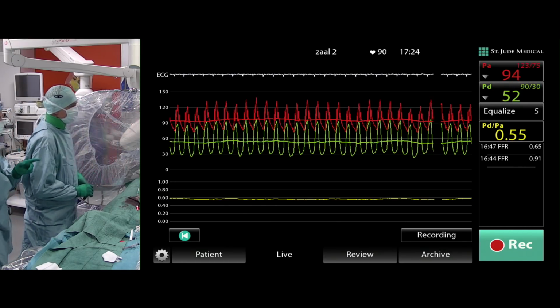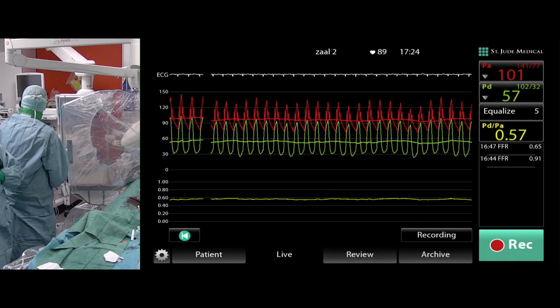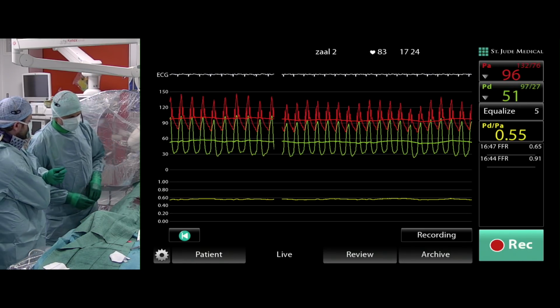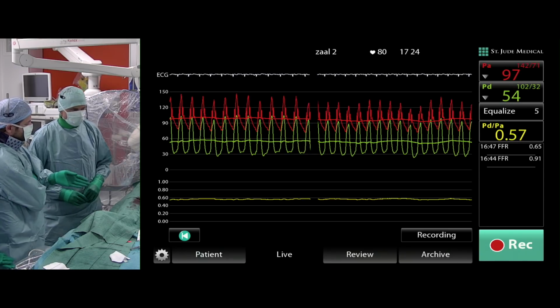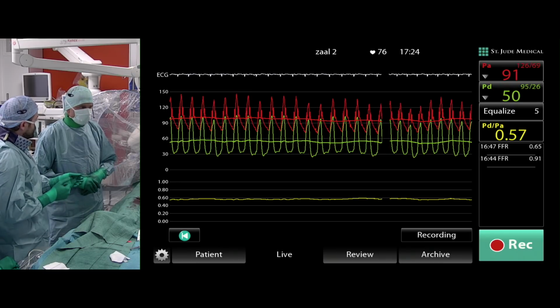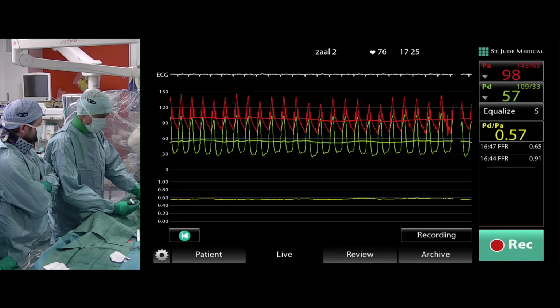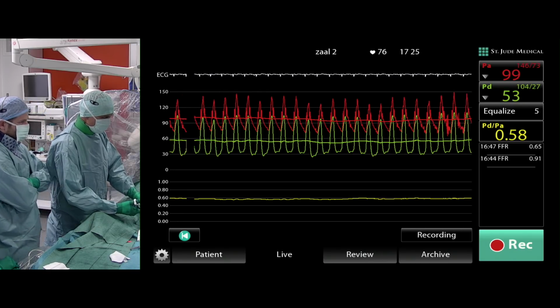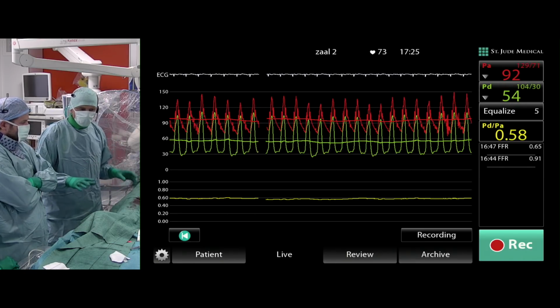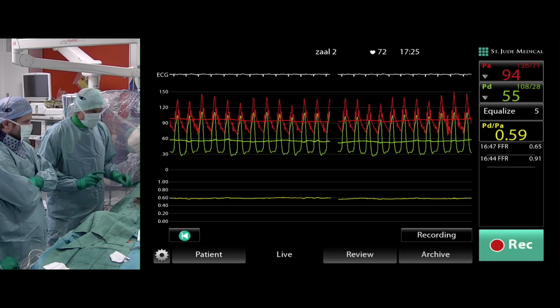But I think this was a very important thing what you mentioned, and I think this is something all the colleagues should remember from this case. If they use an intracoronary agent to measure FFR in case of left main, then the guiding should be engaged during flushing, but disengaged during measuring. If it's followed, then we avoid all the kind of pitfalls. Yeah. But this maneuver is extremely simple. Again, we are going slowly to demonstrate the points, but there is nothing very special.